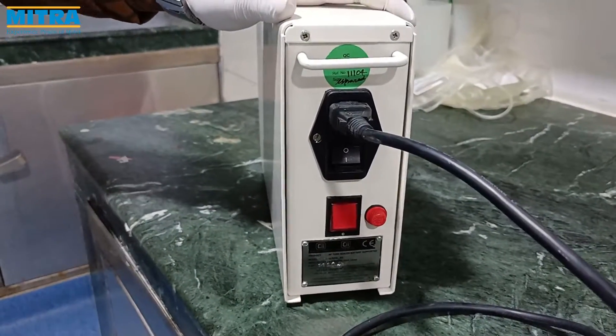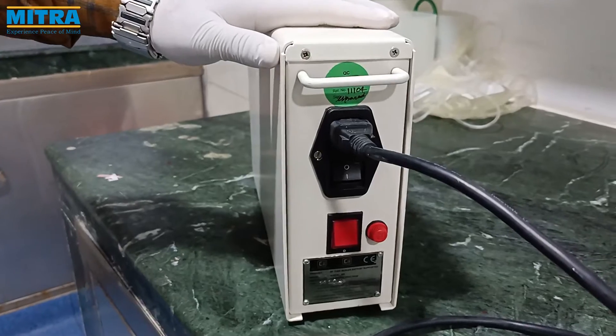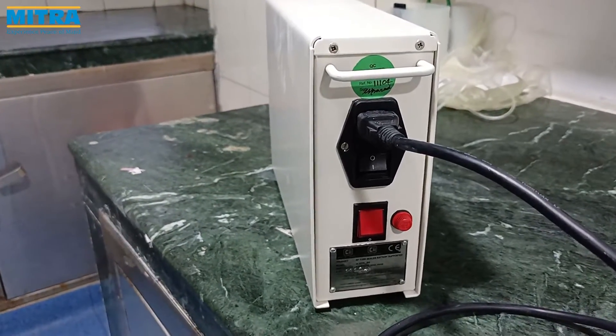The device takes 3 to 4 hours to charge fully and we can get up to 1200 seals in a single charge.